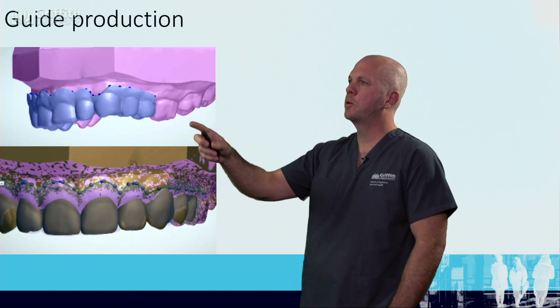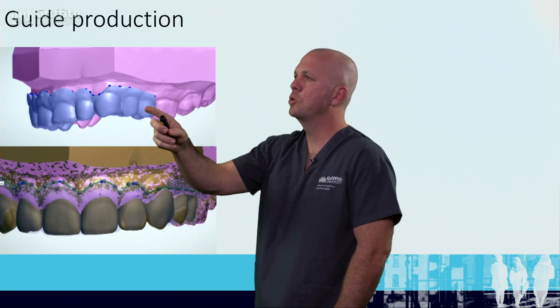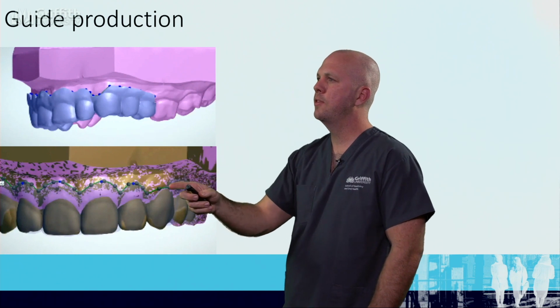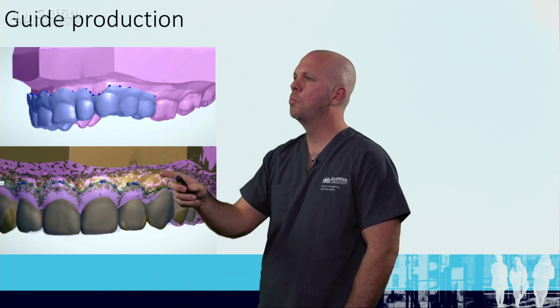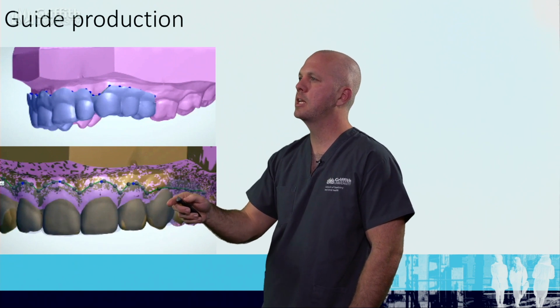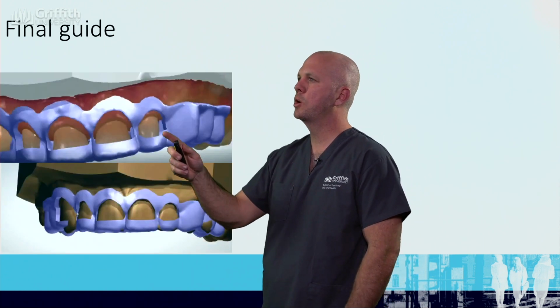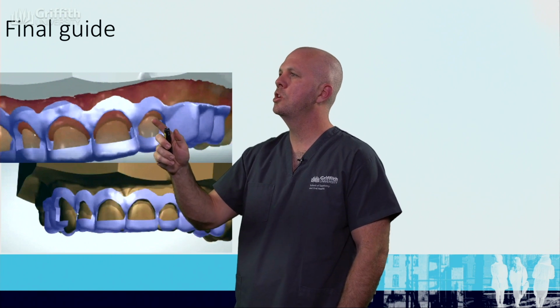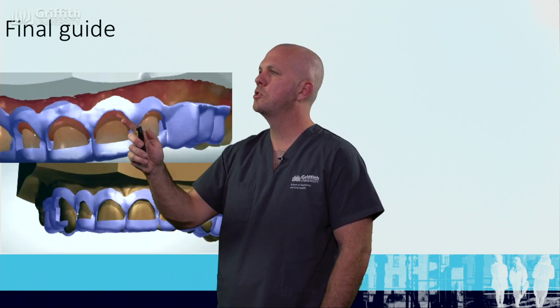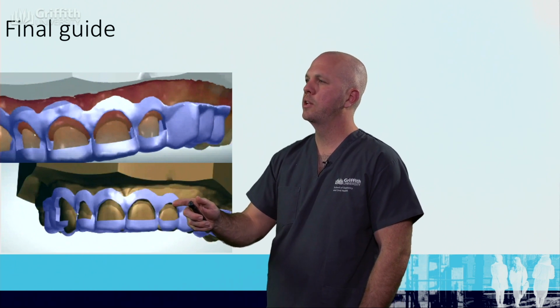What we're doing here is we're creating a file, we're creating an outline here. This will be about 2 to 2.5 mils. And then from that, we're superimposing their original, which is the pink area, to what we've designed the crowns to look like, which is now the yellow area. We'll then take that guide and we'll cut windows. So we can see we've cut a window here and a window here. And then this allows the surgeon to cut away those areas, the gingiva that they can see. And then it will actually show where the crowns should be perfectly.